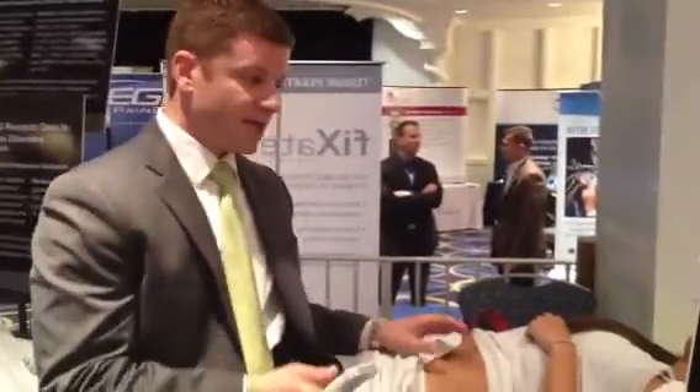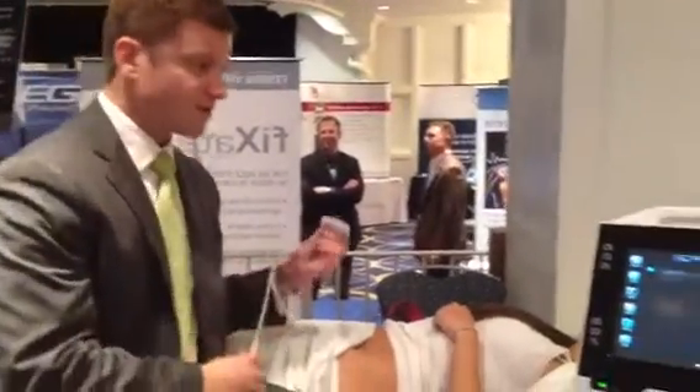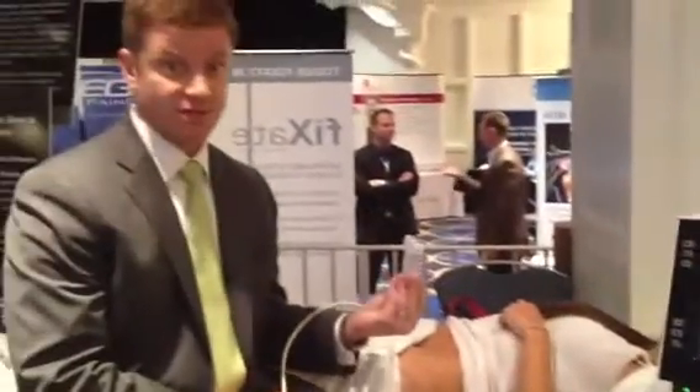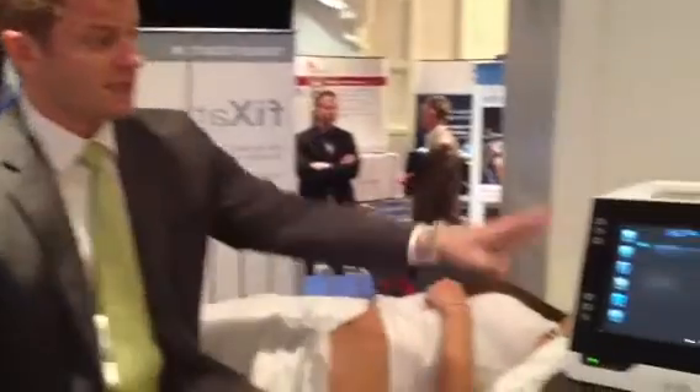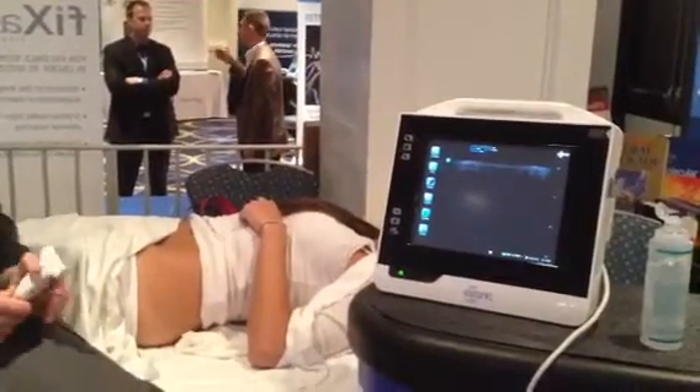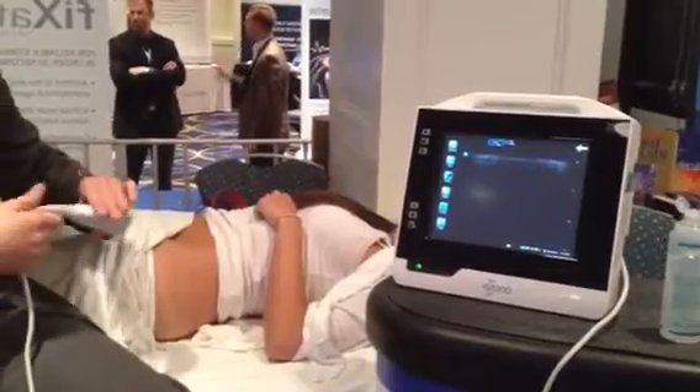The first thing I'm going to do is take the transducer. What I'm using right here is a linear transducer and I'm using the Mesonal 3000 MSK ultrasound system, as well as a model.